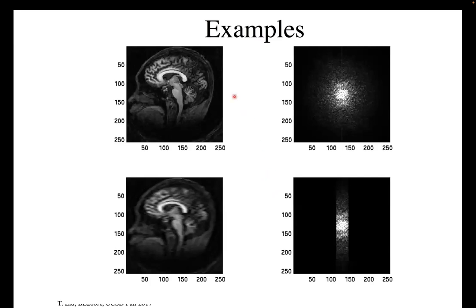And as you might imagine, if I have this set of magnetization vectors here, and this is the Fourier transform, this is our raw data. If I decided I was going to take a subset of that raw data and only image this much, right? When I take the inverse Fourier transform, I get a pretty good picture. I took maybe 1/10 of the data here.